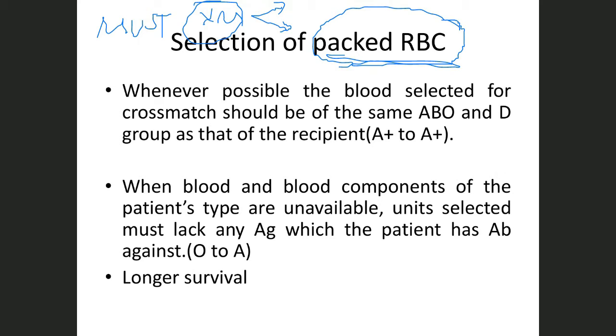For example, we have a patient of type A who needs packed RBC transfusion.